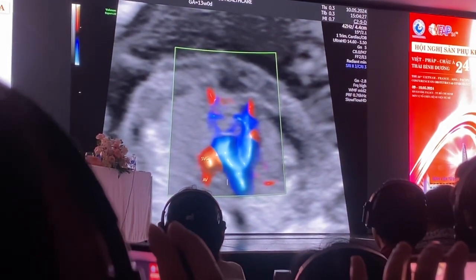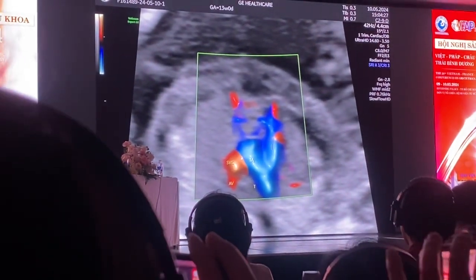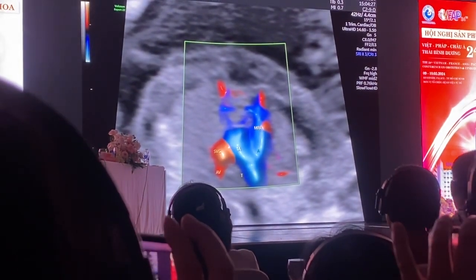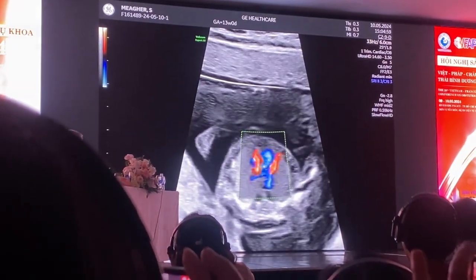And then here is your trachea, and then this is your transverse aortic arch, and this here is your main pulmonary artery, coming out the right ventricle, and this is the arterial duct. So if I look at the anatomy of all those structures, I'll just bring my box down and magnify that up.